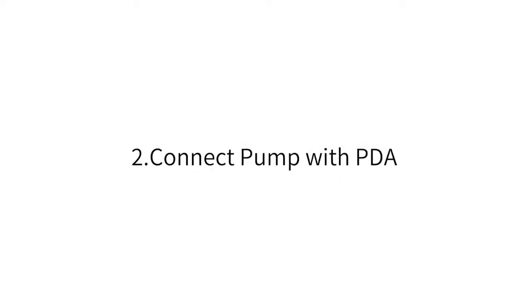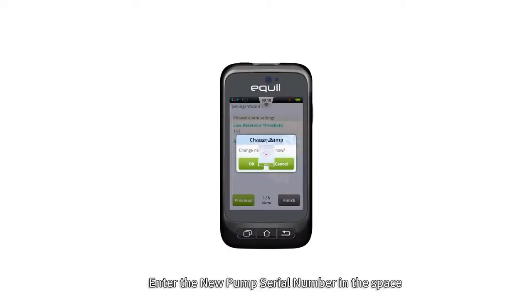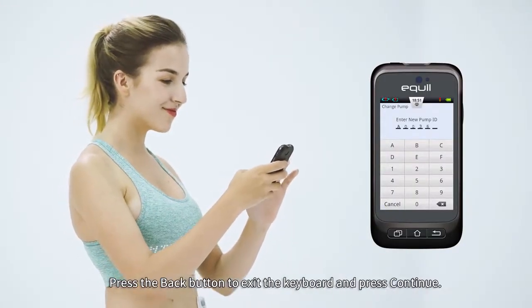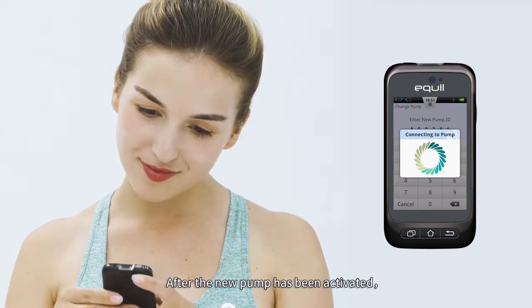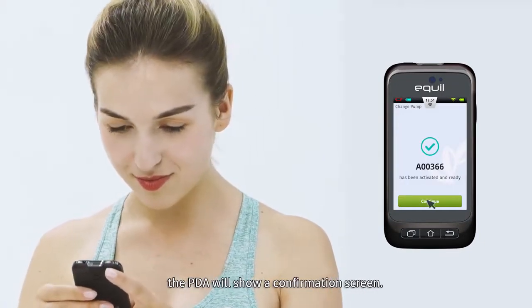2. Connect pump with PDA. Enter the new pump serial number in the space provided using the on-screen keyboard. Press the back button to exit the keyboard and press Continue. The PDA will attempt to connect to the new pump. After the new pump has been activated, the PDA will show a confirmation screen.